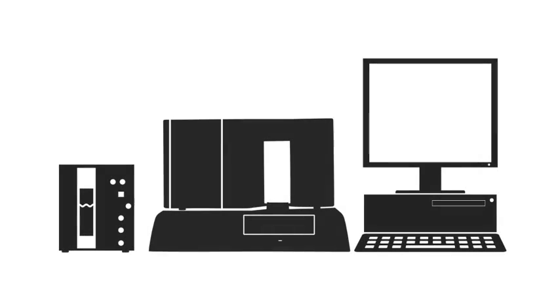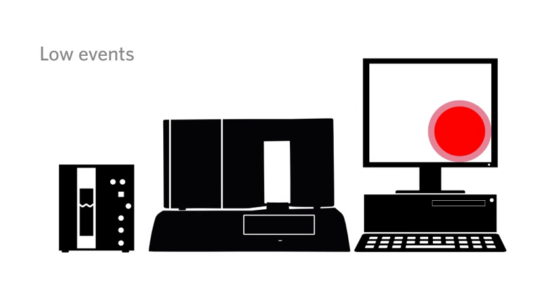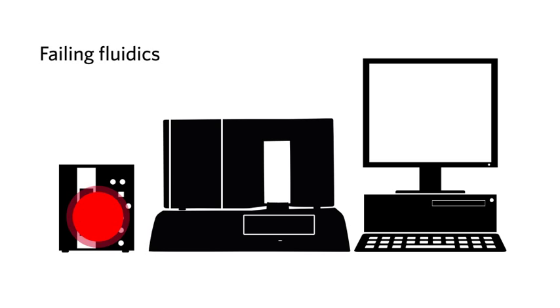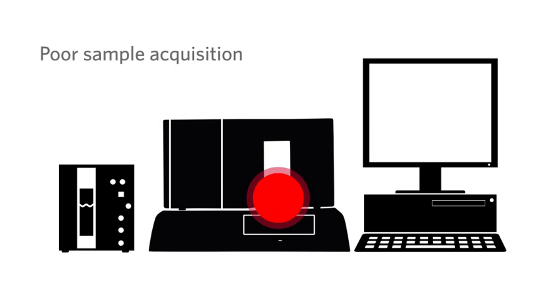This is a comprehensive process that can fix many issues on the Luminex 200 such as calibration and control failures, probe clogs, low events, instrument clogs, failing fluidics, varied fluid levels in wells after sampling, fluid leaks from the valve on the syringe pump, and poor sample acquisition. We help people every day using this process. If you have any of these issues, here's how to do a stringent clean.